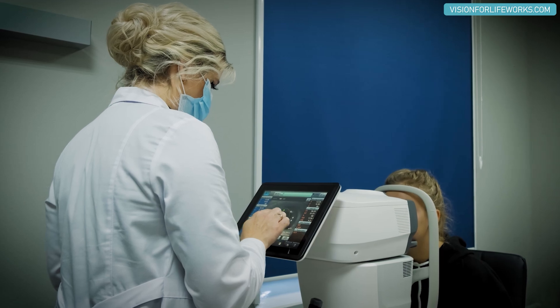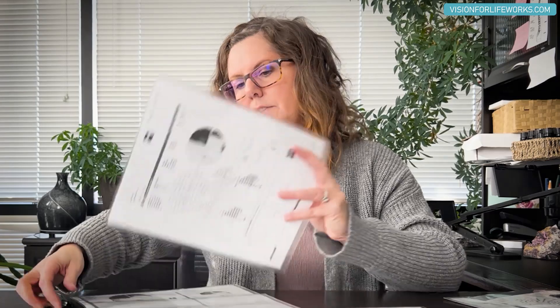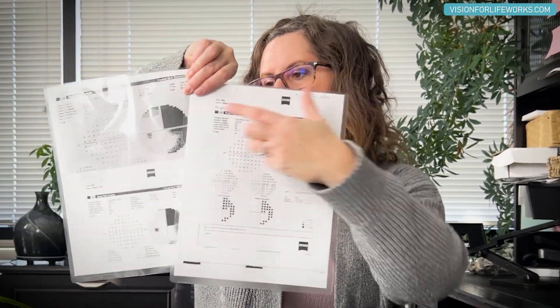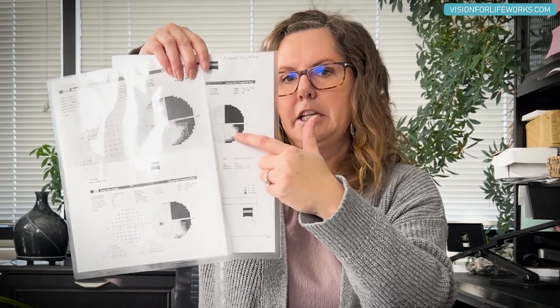Now if the person is really having a tough time initially, they'll often turn the fovea monitoring off, but unfortunately that means the patient may look around a little bit and the test may have some inaccuracies. Sometimes what we'll do is, as they get more accurate and we're seeing changes — for instance, this one actually shows a change: looking at the left eye, this was the initial left eye and this is the new one, showing the patient gaining visual field — as they progress, we'll say we might want to turn the fovea on so we know there's definitely very good accuracy to this test.